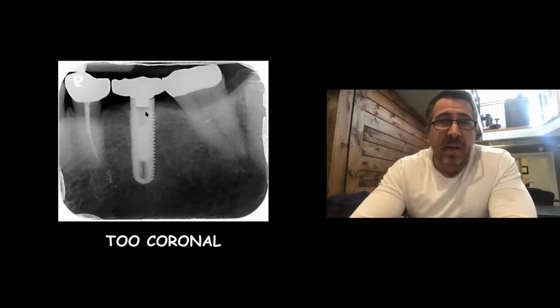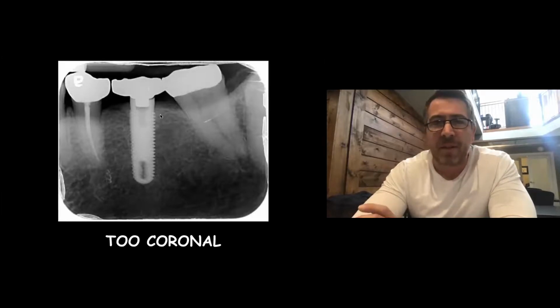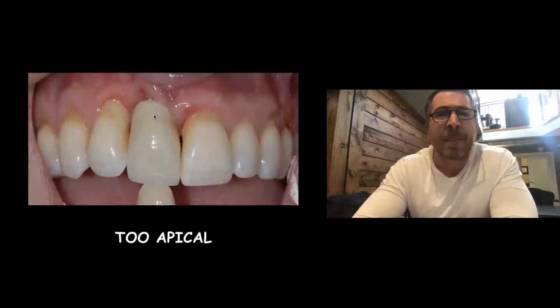And look at this one. I did this one years ago. This implant is like 21 years old. But look, when do you ever see this, where the crest of bone on a molar is actually too high relative to the adjacent teeth? So you think it's great, you open it up as a novice, you make a hole, you fire a big giant implant in, but the shoulder of that implant is terrible, which results in this tiny little squat crown. It's not the right result. This tooth actually required a little bit of reduction of bone, so the shoulder of the implant would result in a nice emergence profile. And that's what Steve had mentioned in his lecture about taking that vertical measurement.